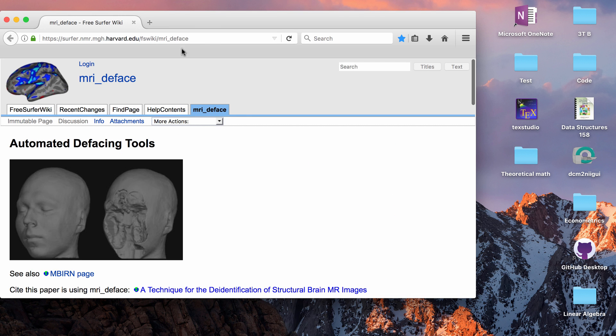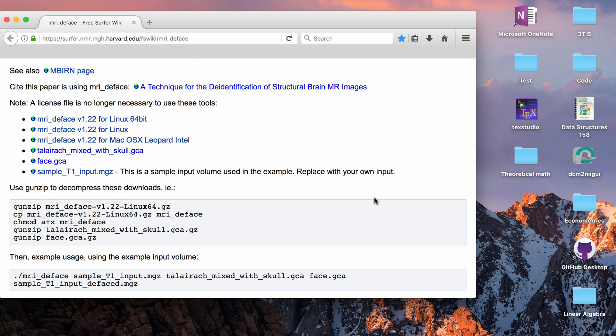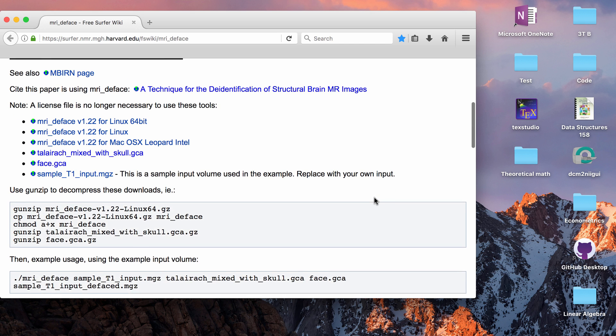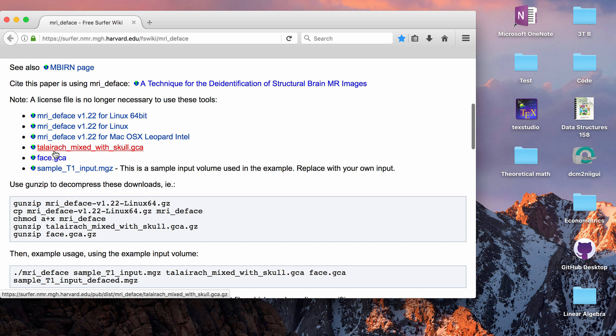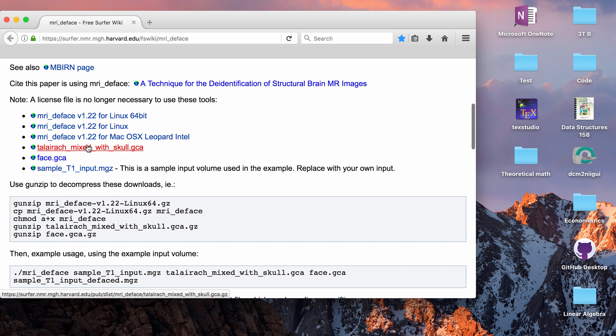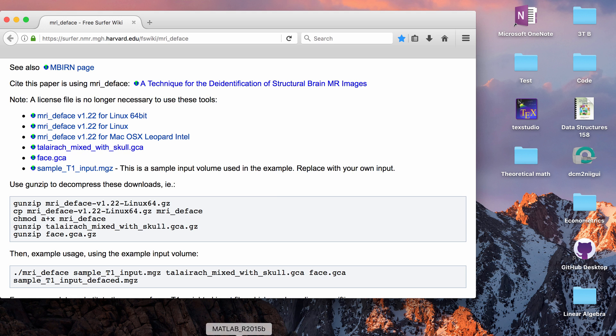So I will put a link to this page down below. To call this function directly you need to use these files that it provides to you for free so you need to have the face.gca and the talairach mixed with skull.gca so when you want to run the function make sure you have those files downloaded already.